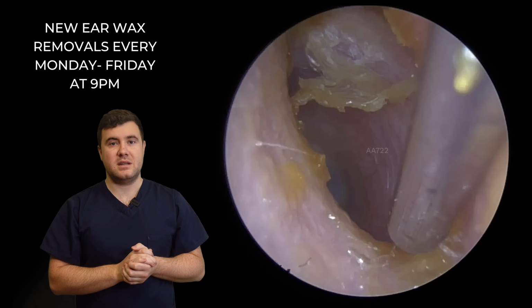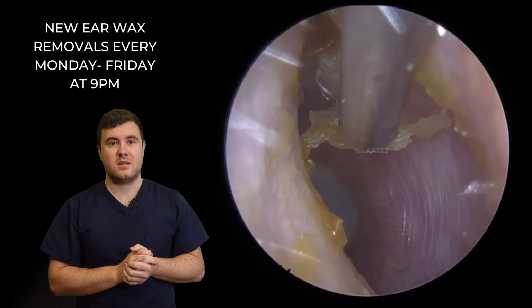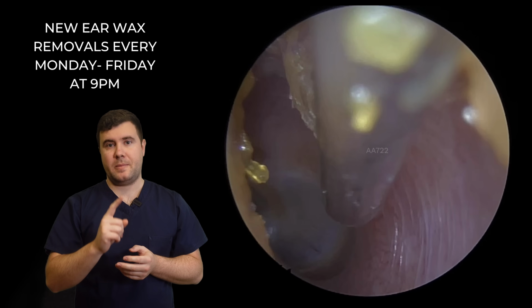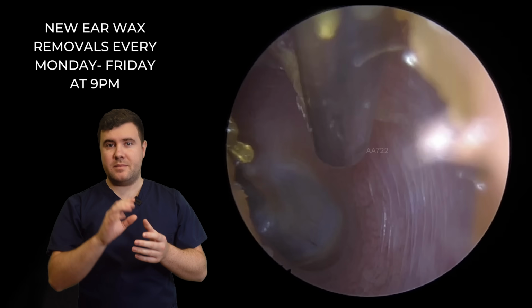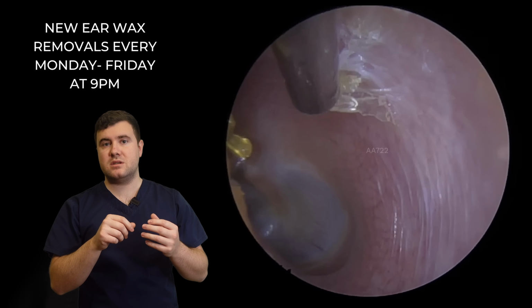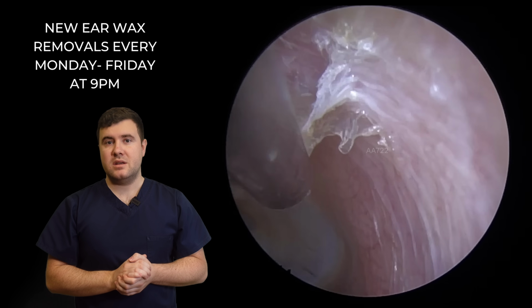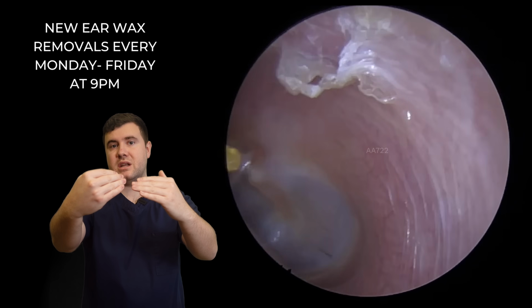Just tidying up these little sticky bits on the edge here. So the oil hasn't quite reached this top section. So we're doing a very similar thing here. I'm using that kind of peeling motion. So we're just trying to see if this breaks away. Here we go, starting to tear away there. So this is where it will be still attached to that newer, fresher skin underneath.